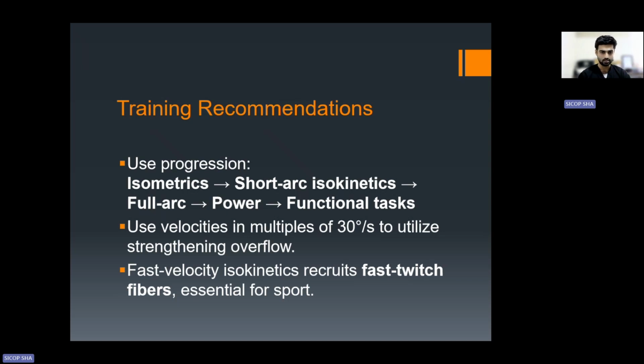According to the research, at 60 degrees of knee flexion, we can get a maximum quadriceps contraction. So we test and train isometrically at 60 degrees of knee flexion. We first start with isometric training. Once isometric training is painless, we can move forward to isotonic and isokinetic training.